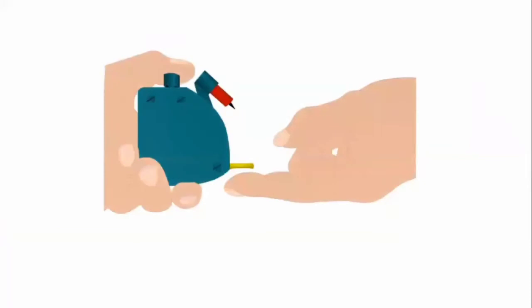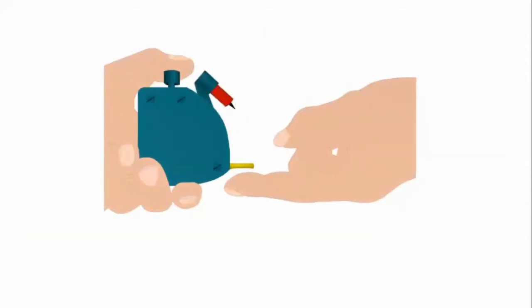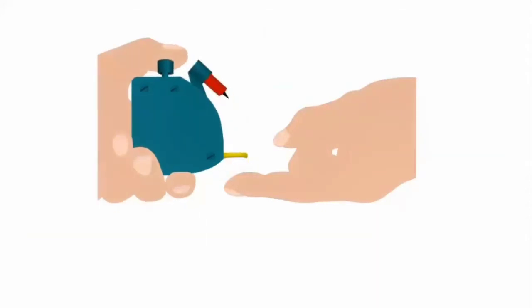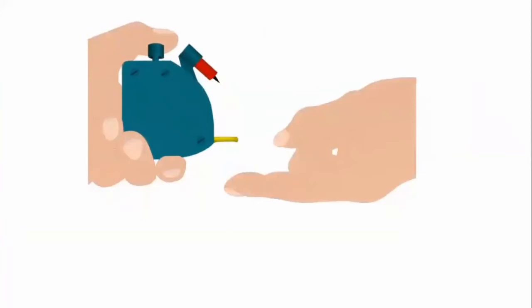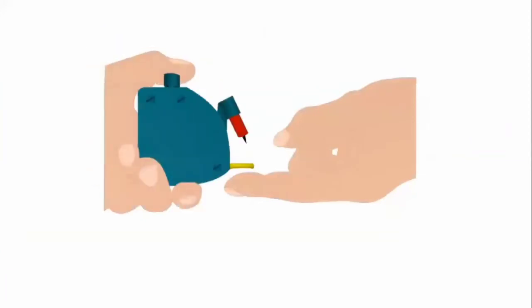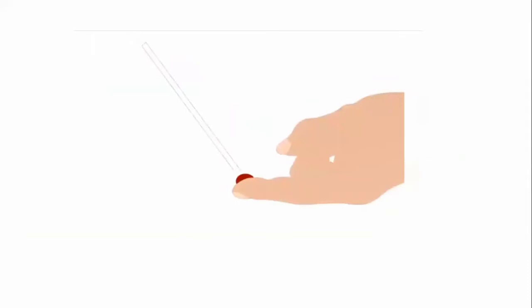First, the fingertip is cleaned with the spirit swab to avoid infection. Then a prick is made with the lancet. As soon as the prick is made, bleeding will start from the fingertip. When bleeding starts, start the stopwatch. After the stopwatch starts, the capillary tube is placed at the bleeding site.